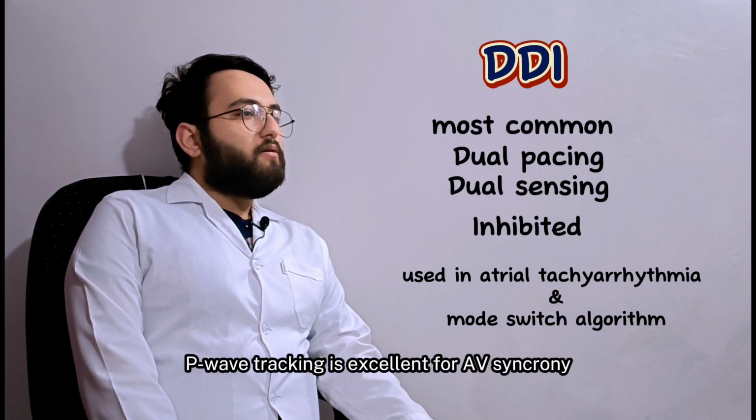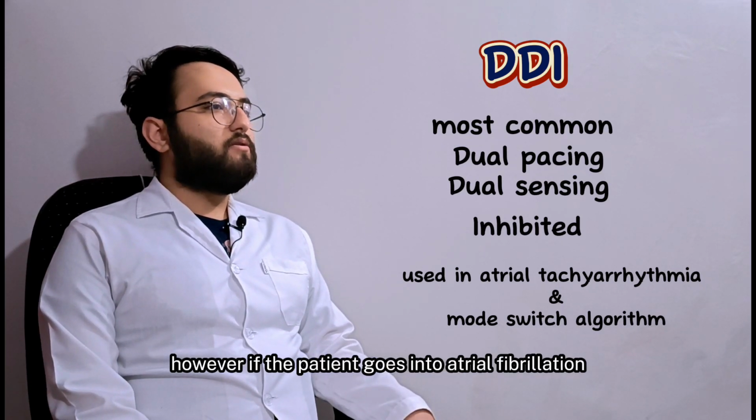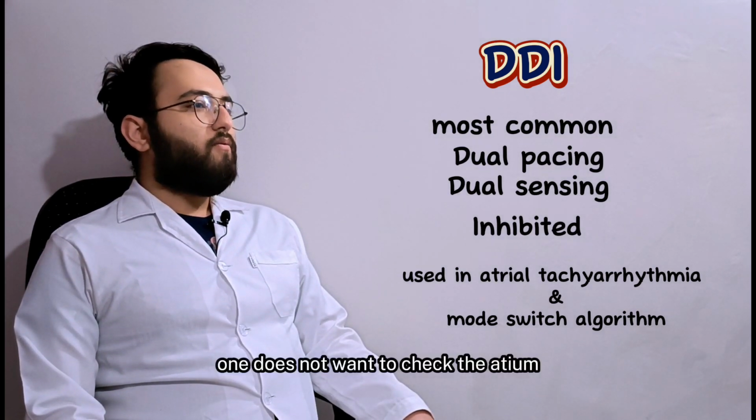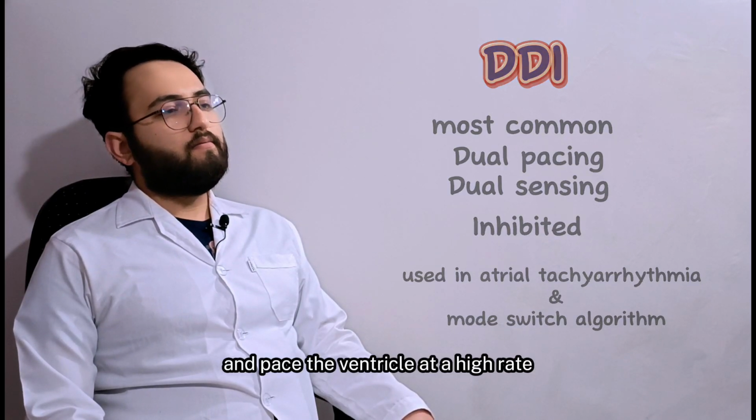P-wave tracking is excellent for AV synchrony. However, if the patient goes into atrial fibrillation with rapid heart rate, one does not want to track the atrium and pace the ventricle at a high rate.